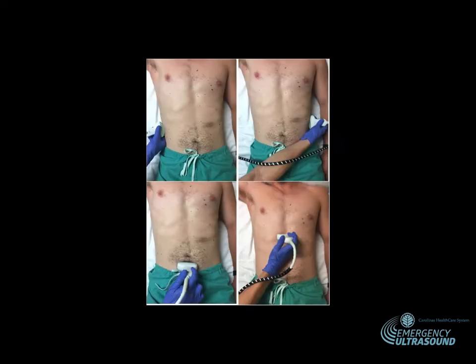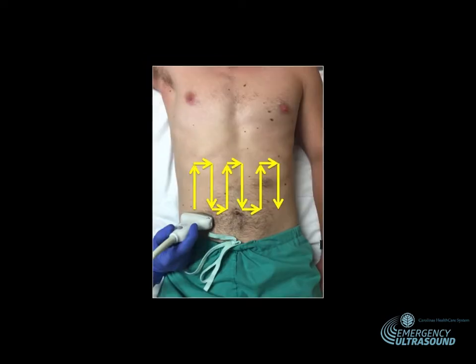So then I start by just screening. I want to look in the patient's right side, their left side, in the suprapubic region. I want to look in the epigastric region, and I'm just doing a quick view, see if I see anything right off the bat. And then I go back and I lawnmower. So I start in the transverse plane, right lower quadrant at their right hip, and I just zigzag all across their abdomen looking for a small bowel obstruction.